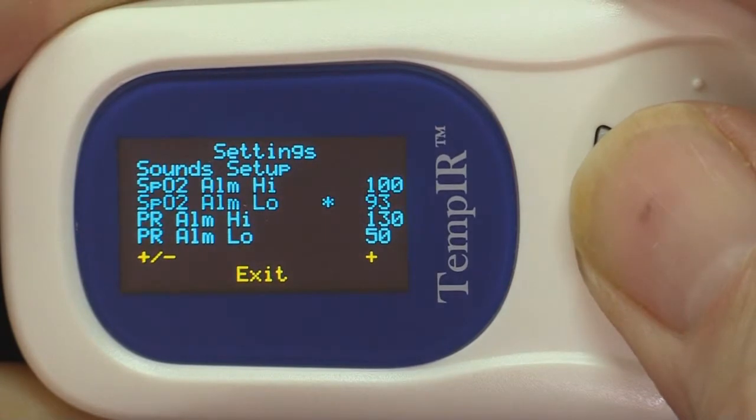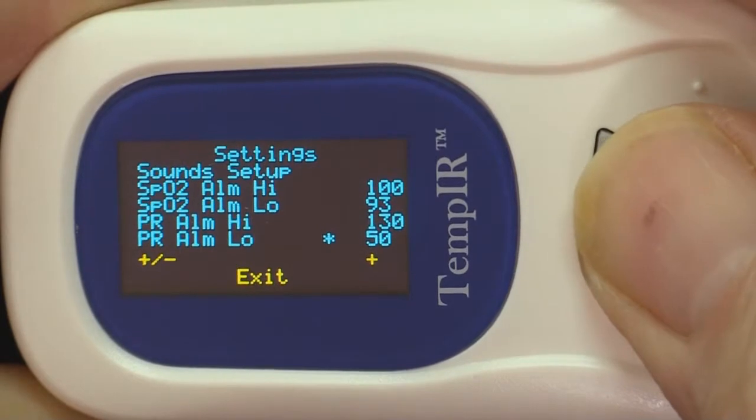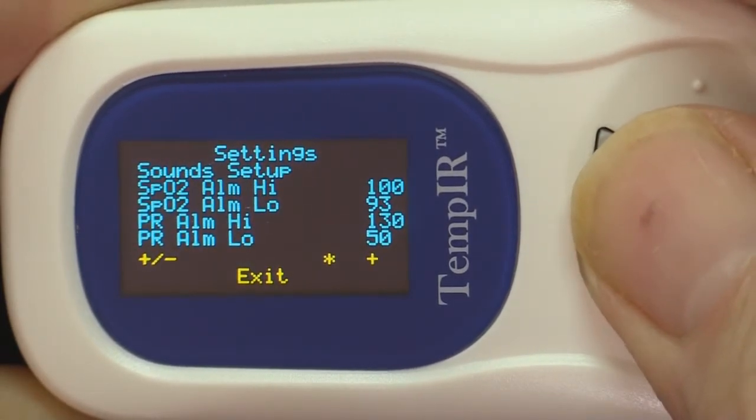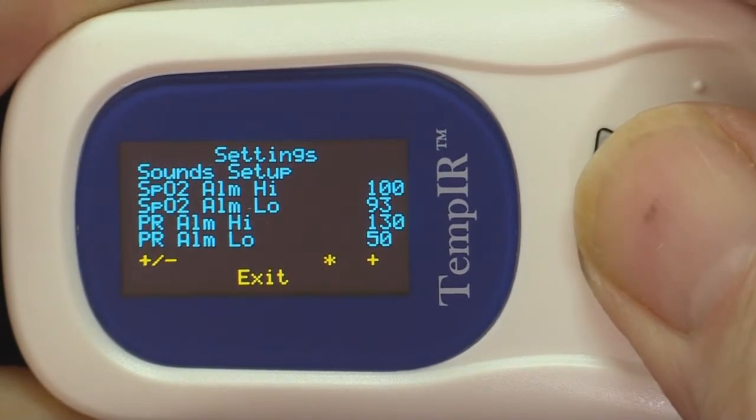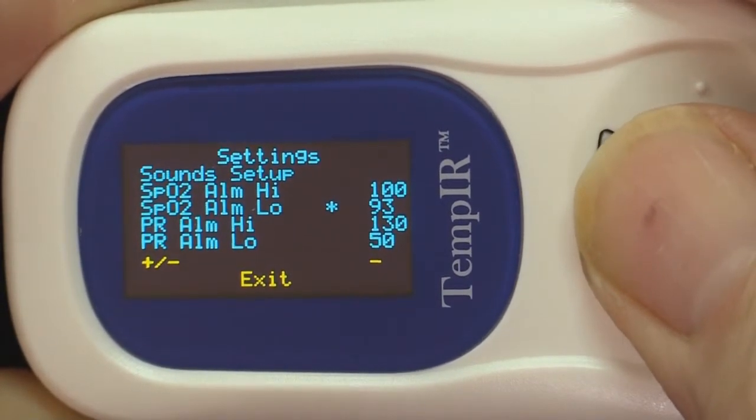For some people the default settings may need to be altered. To do this, make short presses to navigate to the yellow plus and minus sign. The longer press is used to select either plus or minus, then use short presses to navigate to the value you want to change.